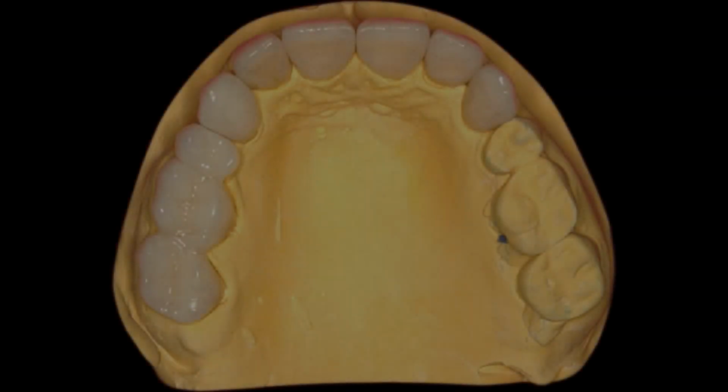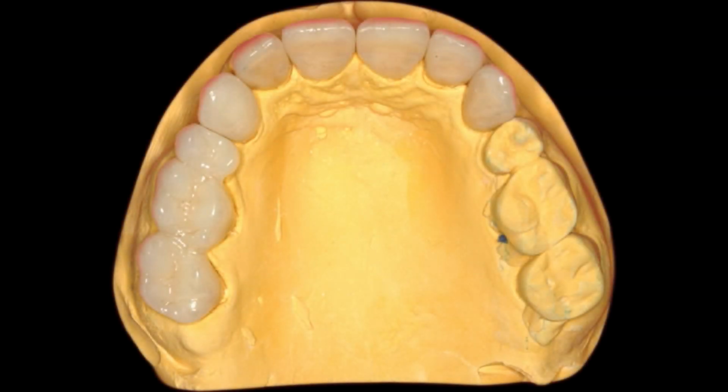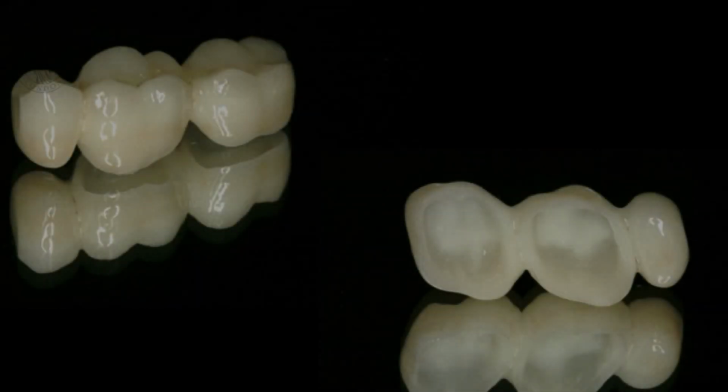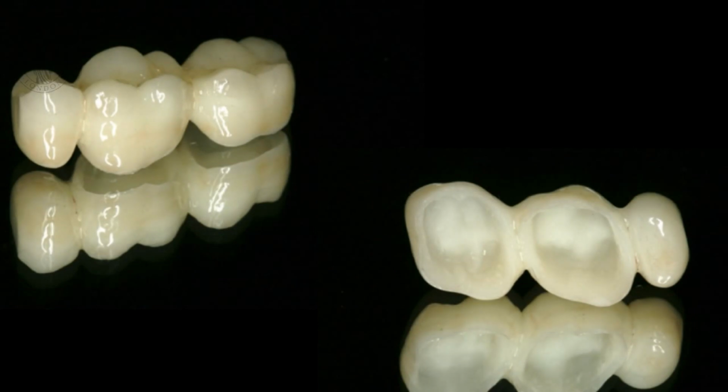And you can see here the model made from the impression and the new full ceramic bridges. You can see this bridge has been done approximately 10 years ago. We're much better now with regards to color, but in this case the patient wanted to have very white teeth as well, which is understandable. If you spend so much money, you want to have beautiful teeth.